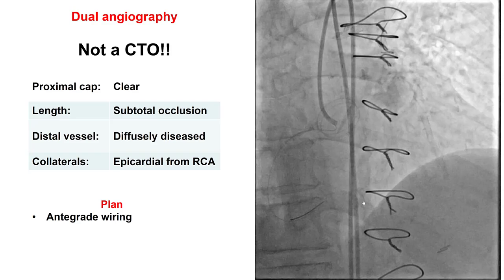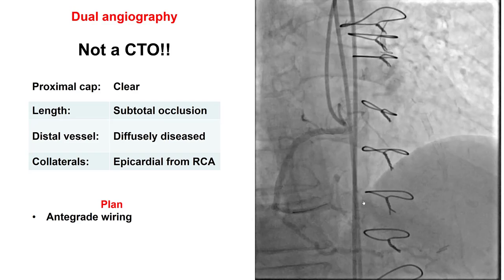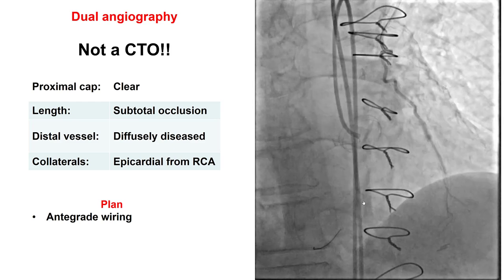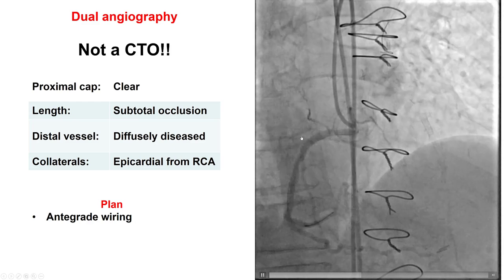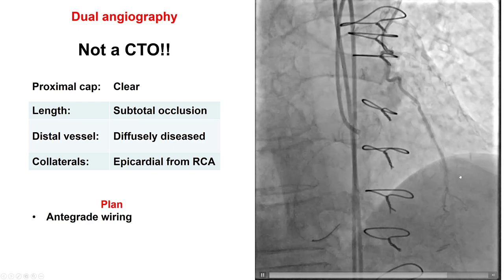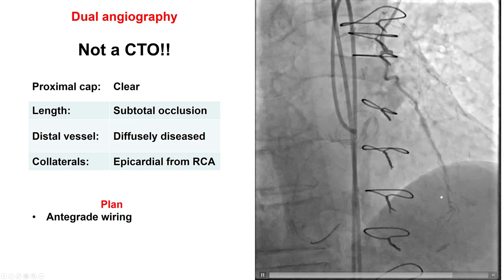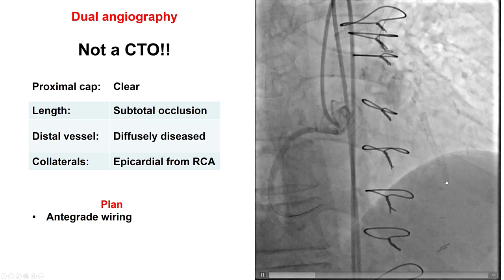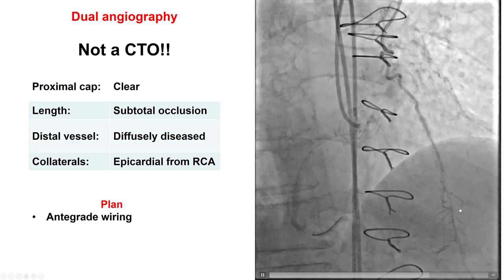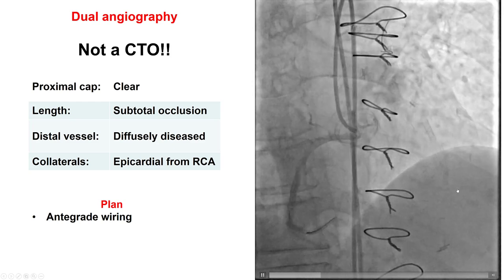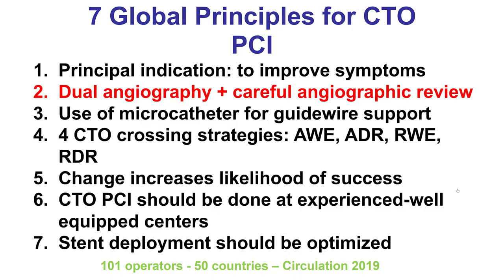The initial referral was for PCI of the LAD CTO. But before undertaking that, the first step is to perform a dual angiogram. Here is a simultaneous injection from the Lima and the native right coronary artery. When we look at the dual injection, it becomes apparent that the patient does not actually have a CTO. Instead, there is a high-grade lesion in the native LAD distal to the Lima touchdown, which is creating competitive flow from the RCA as well as the Lima graft. This is not a CTO, and therefore that makes things much easier and highlights the importance of dual angiography to plan CTO-PCI. In some cases like this one, the patient may not actually have a CTO but may have a high-grade lesion that appears to be a CTO on single injections.